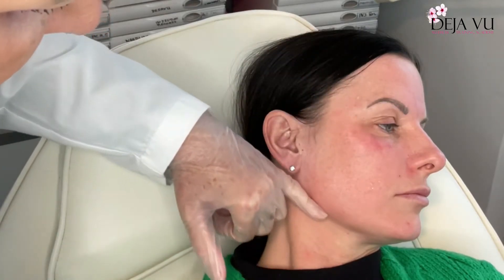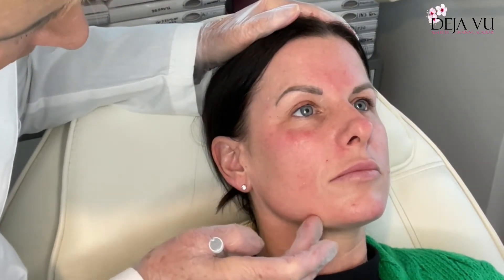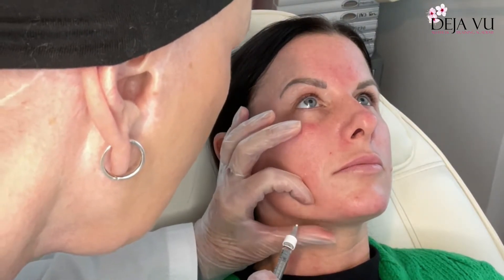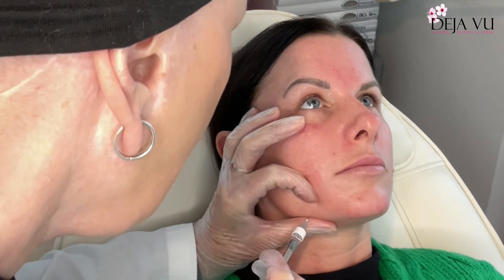As you can see now, she has got more shape there — it's more square. Moving on, as you get older you get a deficit just here, so you've got a hill, a valley, then it comes back out to a hill again. In order to make the jawline strong, I'm going to do three little injections — put the thumb underneath, down to the bone.